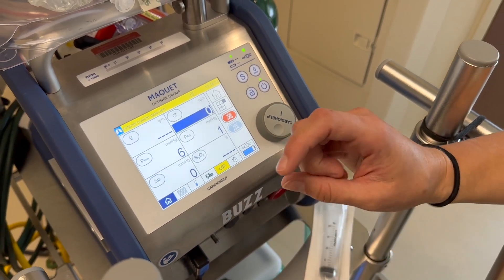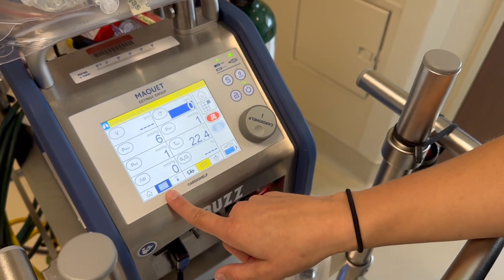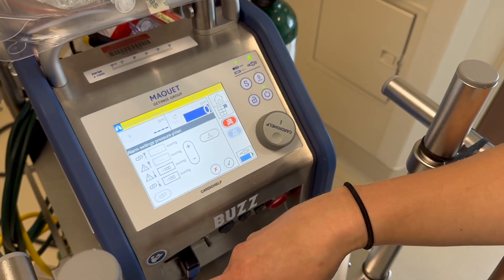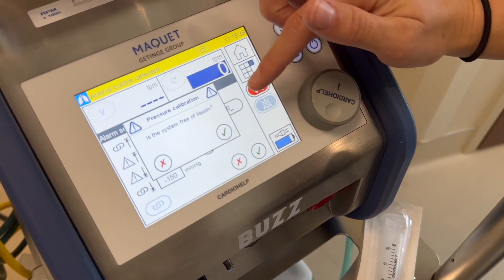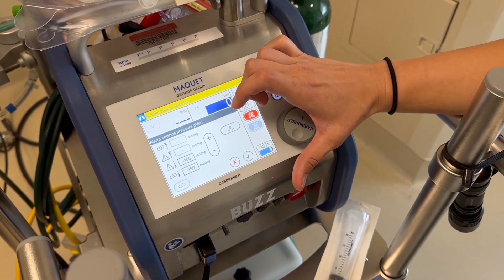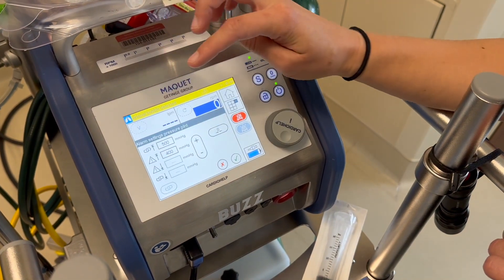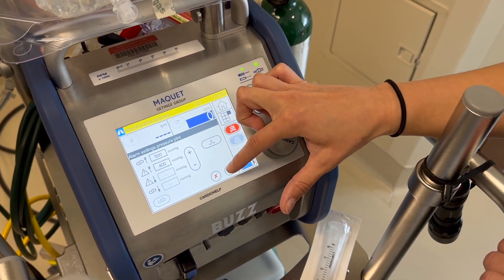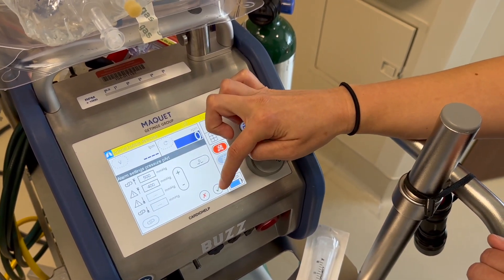Now you're going to zero each of your pressures. Hit this button to bring up all the pressures. Select your P-ven, hit zero — you can only zero your pressures when the lines are dry — hit yes, then green check. That zeros your P-ven. Do the same thing for PINT: zero, check, check. Then for PART: zero, check, check. Everything is now zeroed.